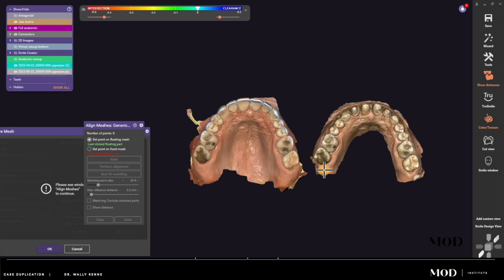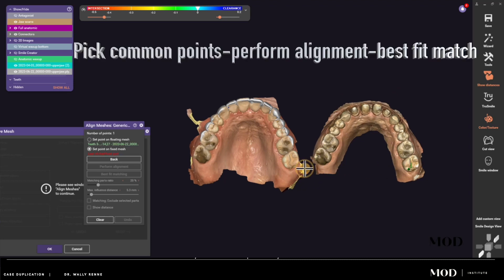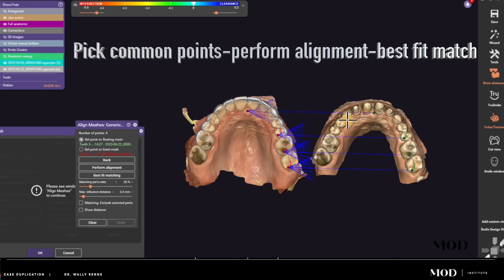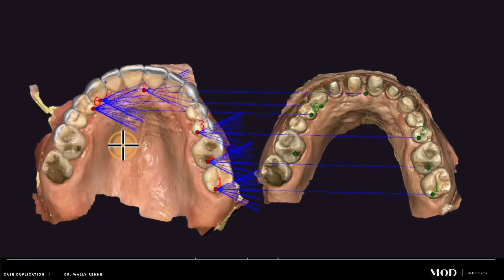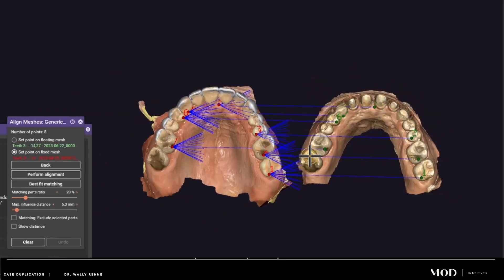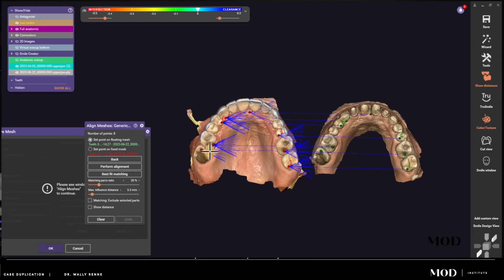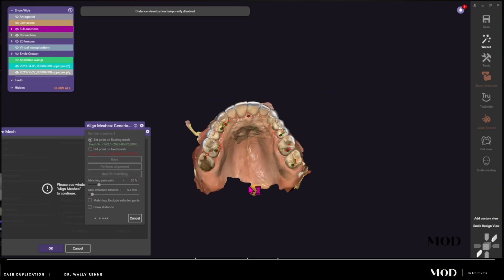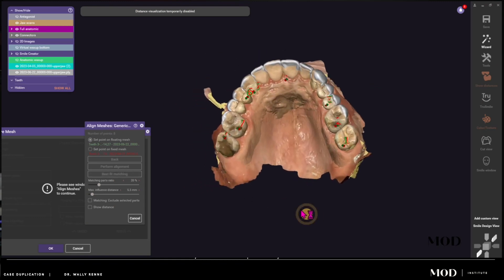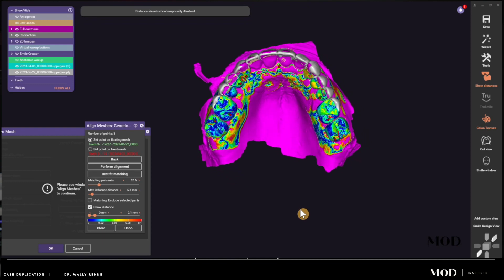I'm selecting common points — it's nice when you have a case like this where you have all these unprepared tooth surfaces you can use for marking dots between the two separate distinct models. We reopened the saved Exocad case from a few months ago when we did the mock-up. Now the patient's in the chair with tooth preparations done, and I want to design my temporaries direct to prep using this alignment feature.